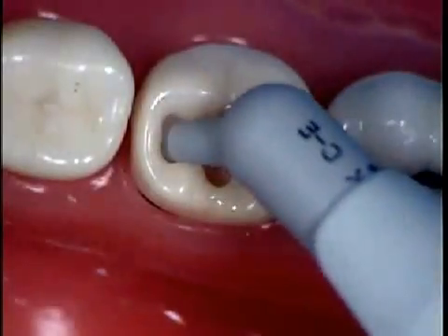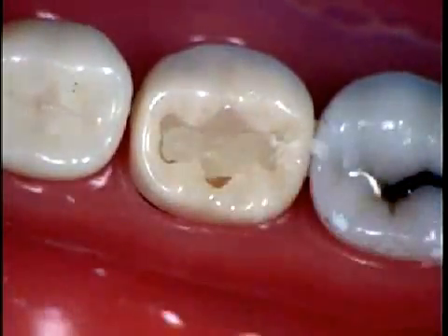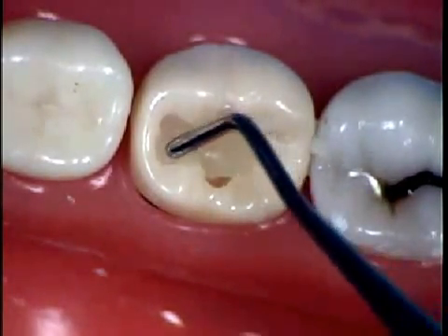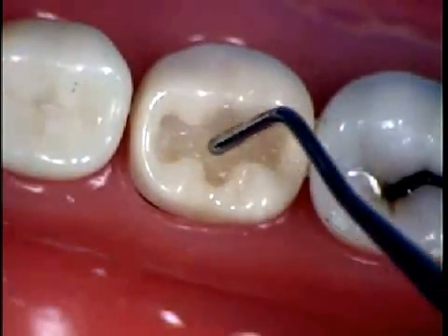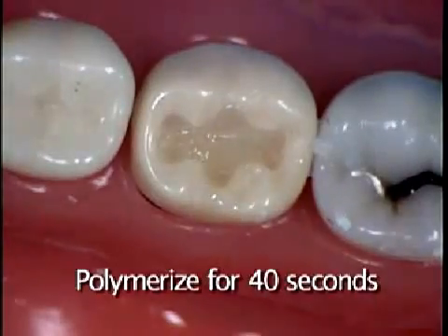The second layer you are going to apply against the lingual wall. You want to have good adaptation of the material against that wall. You want to polymerize for 40 seconds.